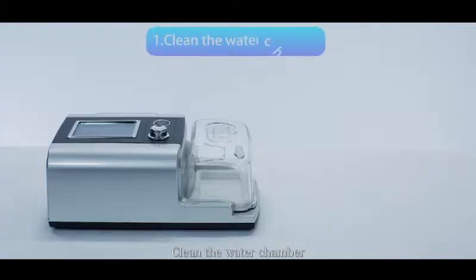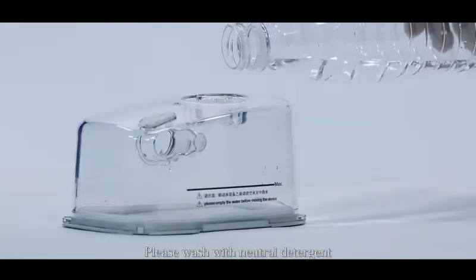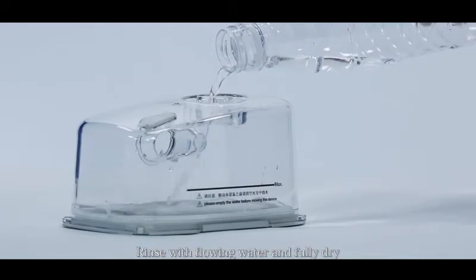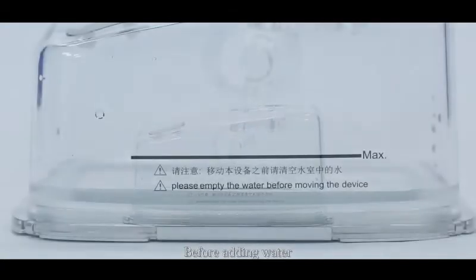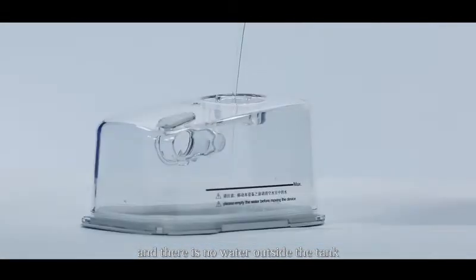Clean the water chamber. Remove the water chamber parallel to the right and wash it separately. Please wash with neutral detergent, rinse with flowing water, and fully dry. Before adding water, make sure the water tank is clean and there is no water outside the tank.